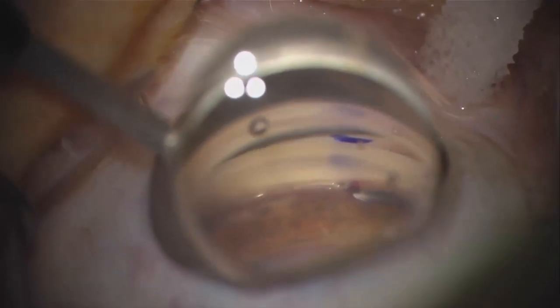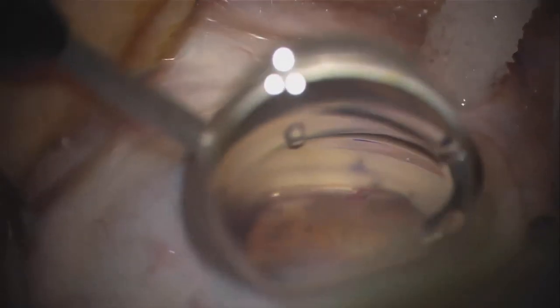Here is an example of initial insertion of the implant which seemed to go in smoothly, but upon examination of the stent positioning, one sees that it is not quite in Schlemm's canal at the tip. Here we see an example of retraction and reloading within the eye. The implant inserter is reintroduced into the anterior chamber and the tip approaches in a parallel fashion behind the implant near the inlet.